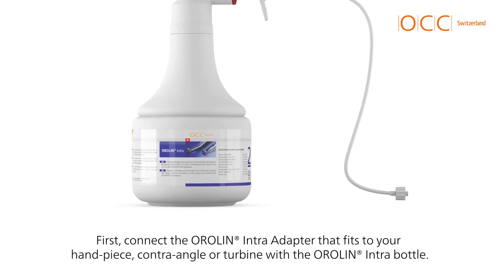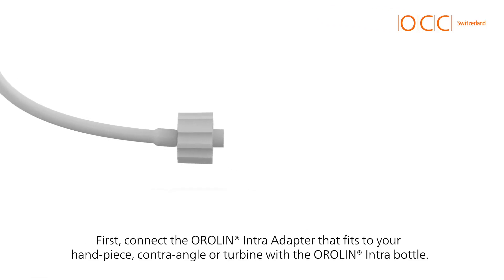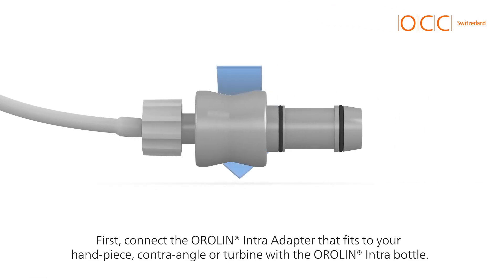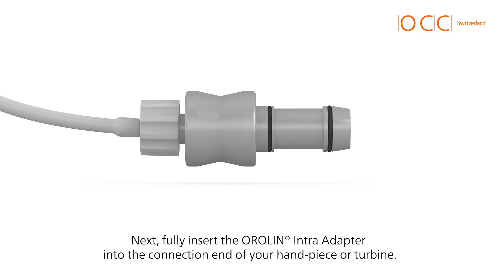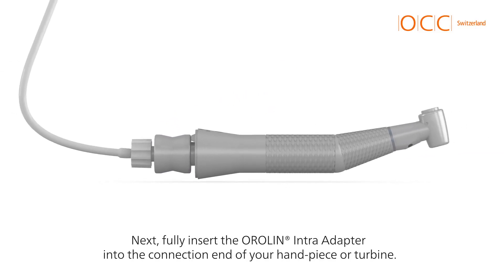First, connect the OROLIN Intra Adapter that fits to your handpiece, contraangle or turbine with the OROLIN Intra bottle. Next, fully insert the OROLIN Intra Adapter into the connection end of your handpiece or turbine.